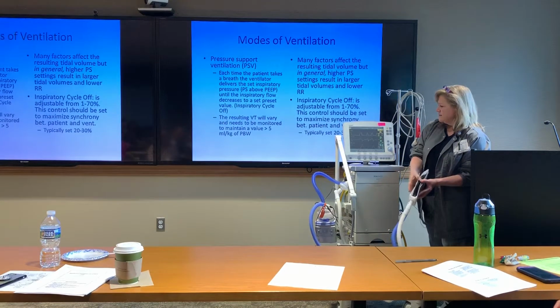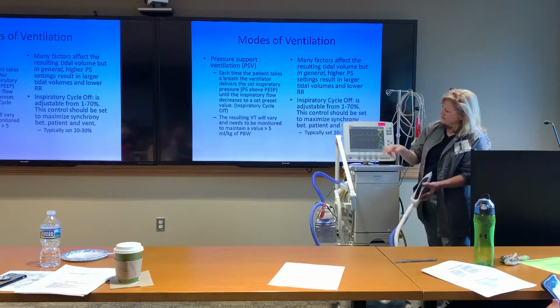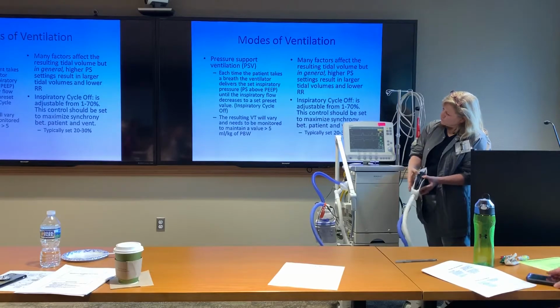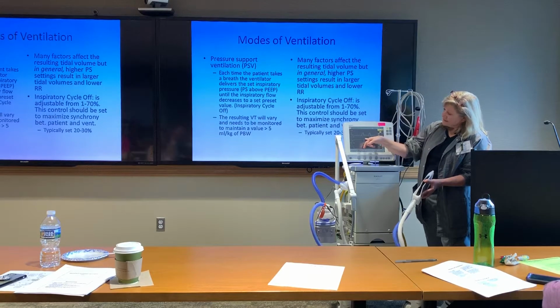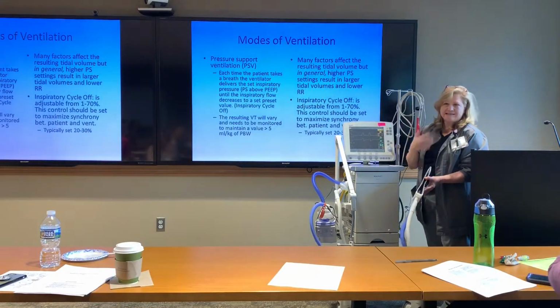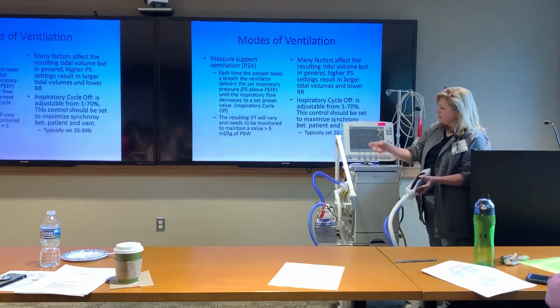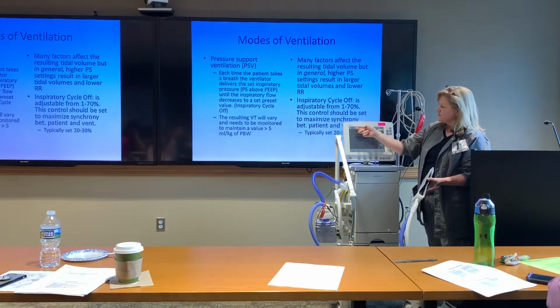Anyhow, all right. So that's kind of the way it looks. You can see how these pictures look a little different. I don't know if you can see that. The way the pressure support works, as I said, it goes up to that pressure level and then again tapers off. So it's got that decelerating pattern, but it tapers down to a point that I set. Okay. So when patients don't look as comfortable on it, there's all kinds of choices that we have as therapists to tweak with these things.